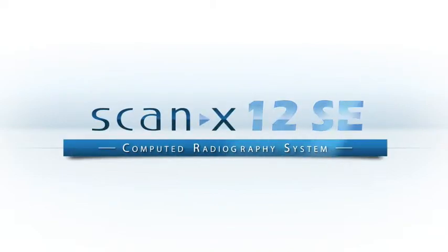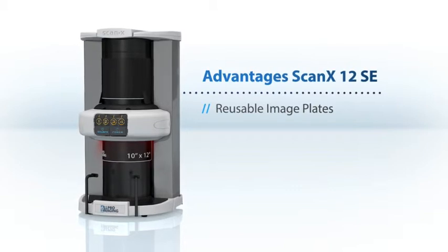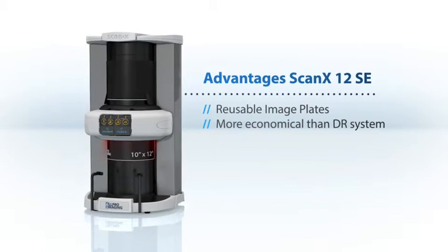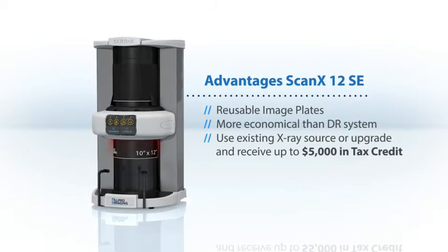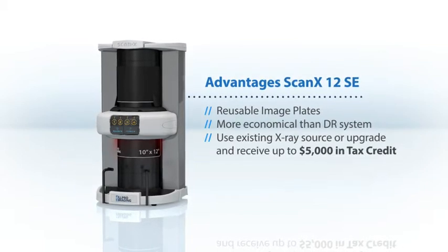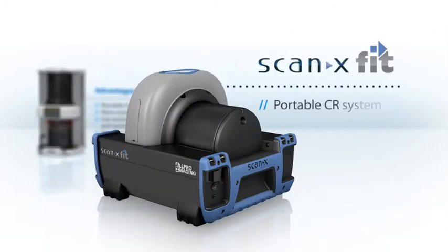Advantages of the ScanX 12 SE include: imaging plates are reusable for over 2,000 exposures per plate. This system includes two sets of 10 by 12 inch imaging plates, allowing your practice to be more efficient at a far more economical price than any DR system. You can continue to use your existing X-ray source to keep expenses down, or upgrade to an Americans with Disabilities Act compliant base and receive up to $5,000 in tax credit. We also have a portable option for practices with multiple offices.